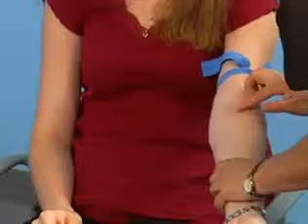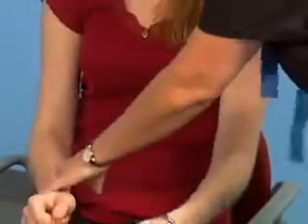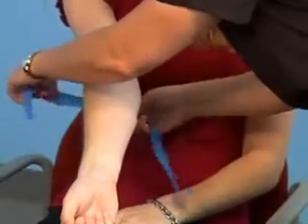With a tourniquet in place, thoroughly assess the veins of first one arm and then the other to determine the best vein to use.